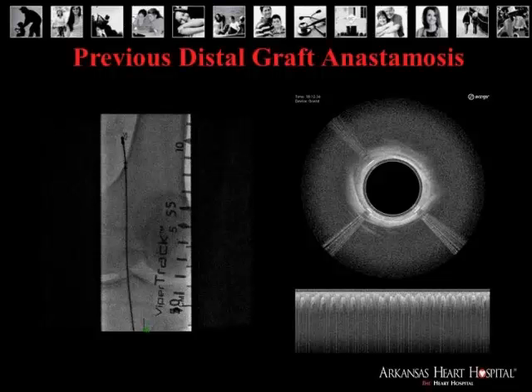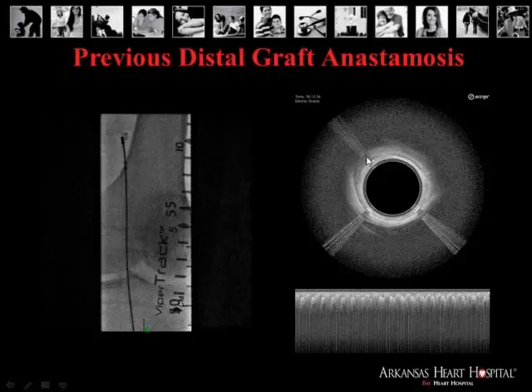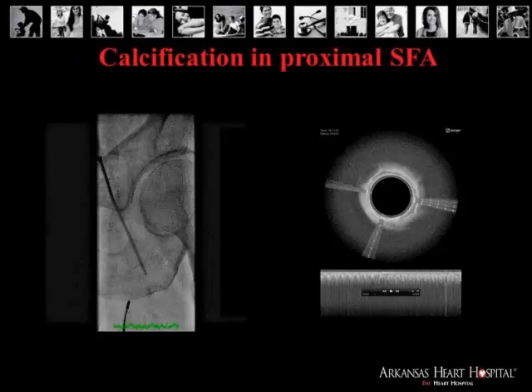This is the location of the previous anastomosis site for the graft, and if we look at the appearance here, we can see that there is a visualization of a space right behind the catheter. Again, we pointed away from that space to avoid going into the graft, but rather to continue into the lumen. We do see some layering of this segment, so I think our position is good. We continue to advance the catheter, the entire time being able to identify vascular structures, knowing that we're intraluminal.